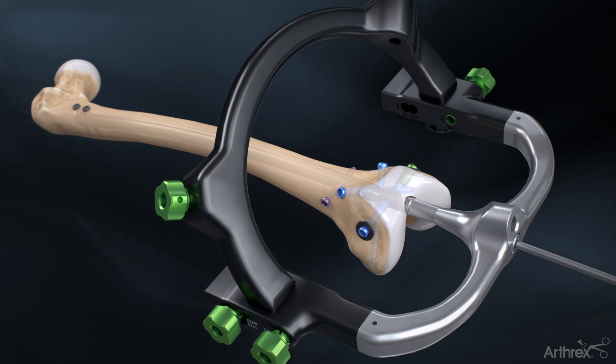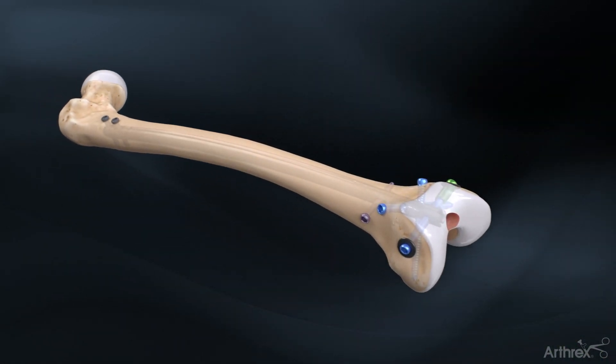Uncouple the targeting guide from the nail with the ball hex driver and remove it to complete the nail implantation.